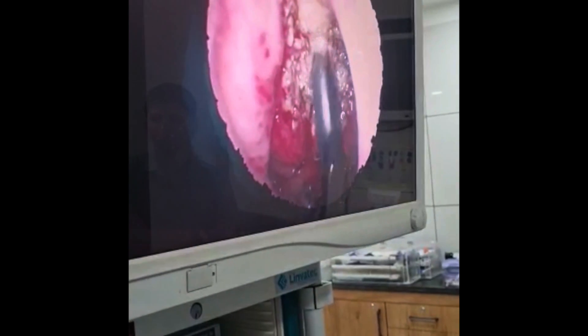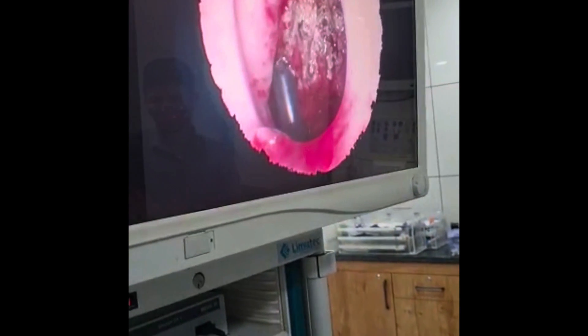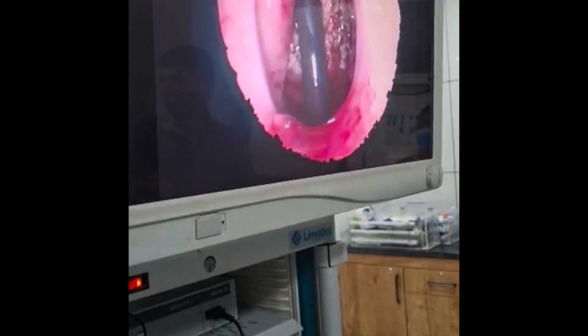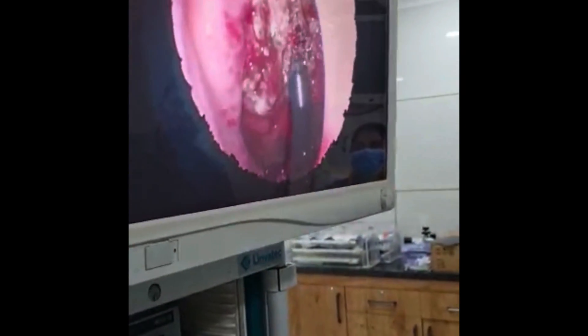I am operating using a zero-degree transnasal endoscope, and I am using the adenoid wand through a trans-oral approach, so both transnasal and trans-oral routes can be used simultaneously. You can use a zero-degree transnasal endoscope or a 70-degree trans-oral endoscope, but you must resect the adenoid completely. Both microdebrider and coblator are excellent methods.